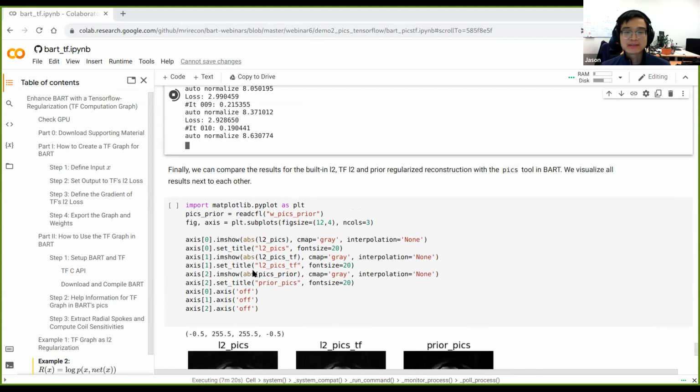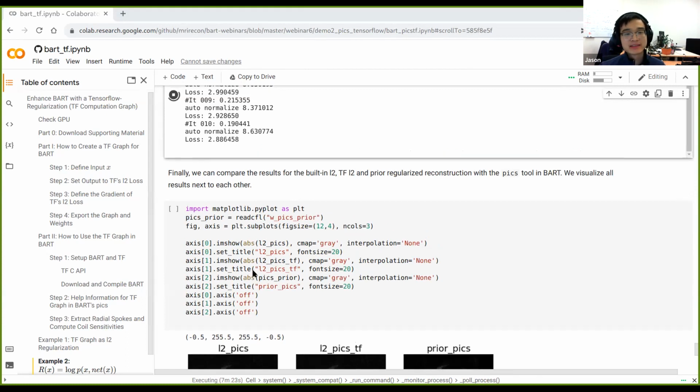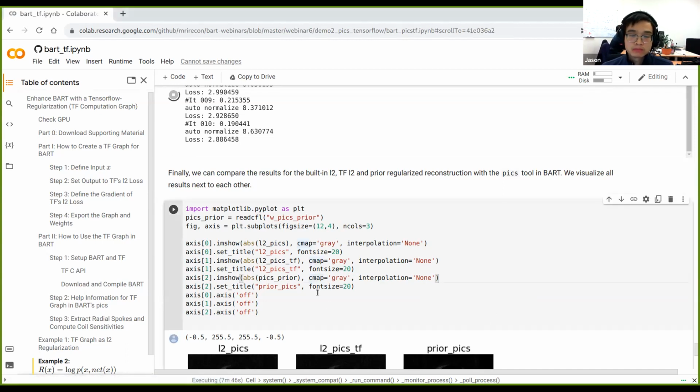Yeah, that's really great. One of the things I really like about BART is the ability to mix and match with other languages like Python. And it's nice to now have these machine learning libraries supported as well. So we don't want to tell you how to use BART. We want you to use it in the best way that works for your workflow. And that might be pure Bash. It might be a mix of Bash and Python. And it might be with these other libraries as well.